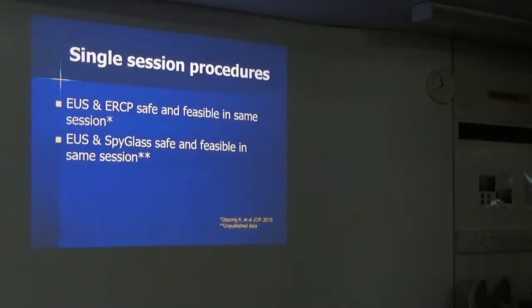It's probably preferable to do it under general anaesthetic, because then obviously the patient's more relaxed and in a controlled environment, because the procedures can take over an hour, sometimes an hour and a half or longer to do if you're doing two of them at the same time.